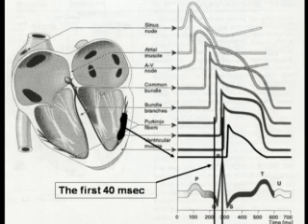Now the epicardium actually repolarizes first. And evolutionarily, there's an advantage to that. That way the signal to depolarize can only go in one direction. It's a scorched earth policy. It can't turn back to the endocardium and re-enter on itself. When it does, that's called ventricular fibrillation. So this interesting quirk of nature then allows our T wave to point in the same direction as the QRS. It's the reason T waves and QRSs go in the same general electrical vector. Now if I change that somehow, well, the first way to change it was what we talked about earlier, and that's a block.